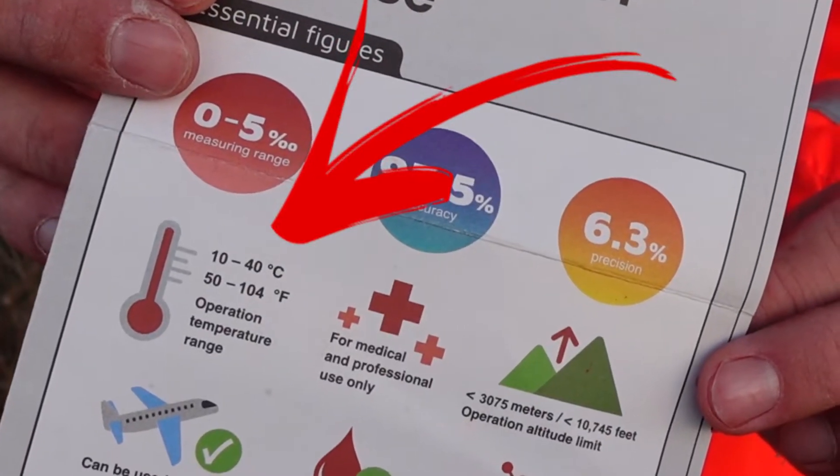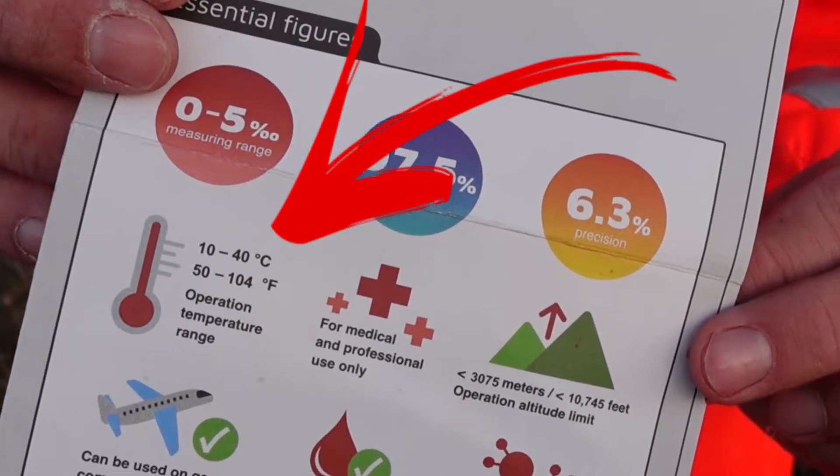To be honest, the manufacturer warns about it in the leaflet — but come on, a device from Finland should work in almost arctic temperatures, shouldn't it?